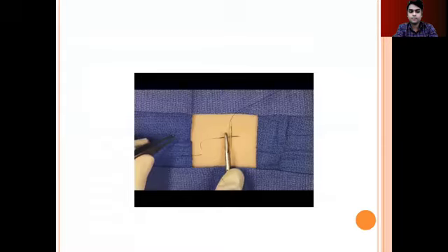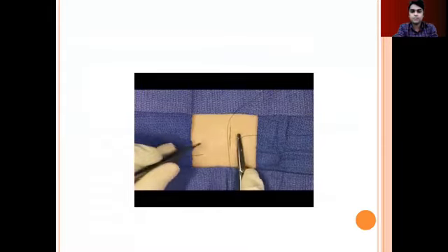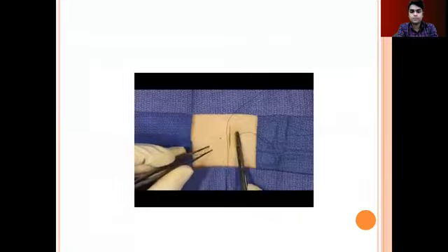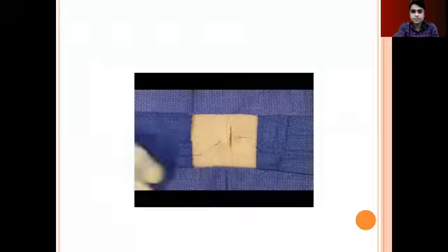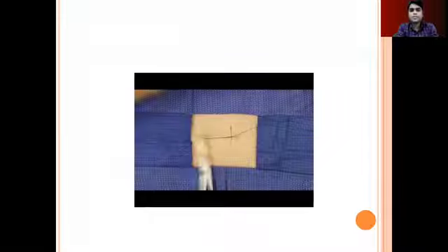Interrupted suture. It starts at 90 degrees, moves somewhat outwards as it follows the curvature of the needle, and exits on the contralateral side of the wound in a similar fashion. Pulled through gently, and gently tied. Suture material is tied.